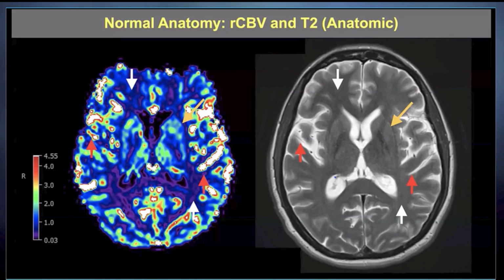We may administer a single dose, but maybe due to cardiac status, there may be some variability in terms of the amount of contrast that gets to the brain, in terms of the rate of injection or what have you. And so we always use these normal appearing white matter regions as internal control. So each patient is basically, during that examination, serving as their own internal regulator, or internal reference, so to speak. So that's the whole reason why we're interested in looking at normal appearing white matter.